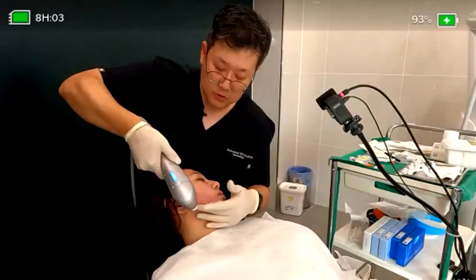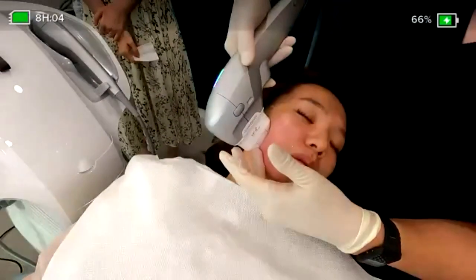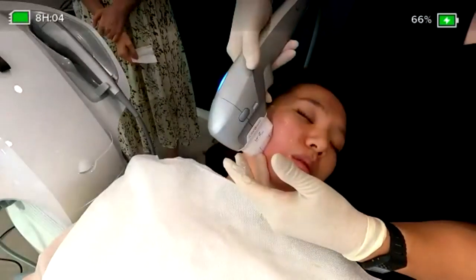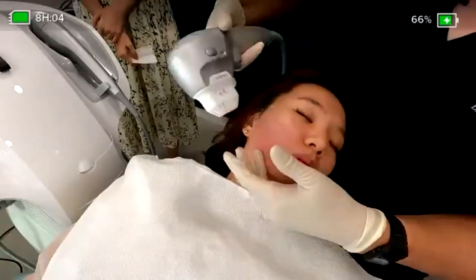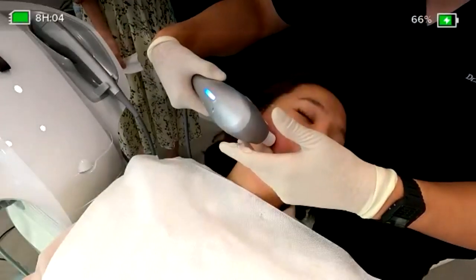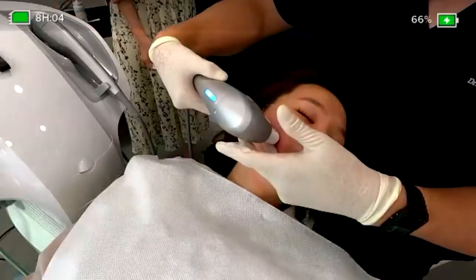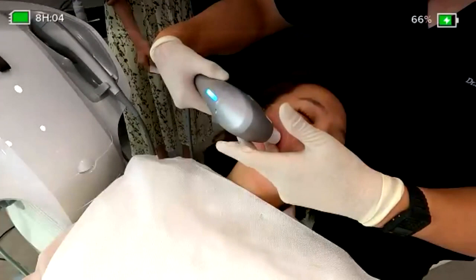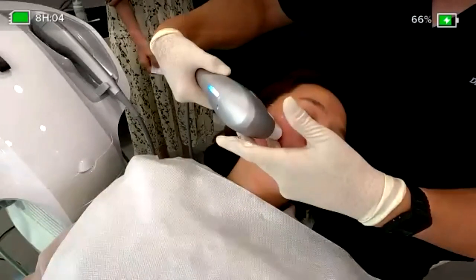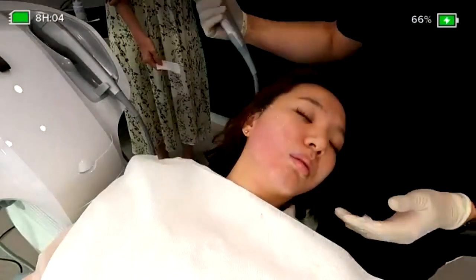Yeah. So we will do 2 more passes to the lateral treatment. The best way to have a satisfied contour correction is to make a map on the patient's face. And if you make the patient participate in the mapping, it is the best. So we can draw lines together on her face, so we can make a focus, and it is a really tailored and customized approach for it. Okay, then.